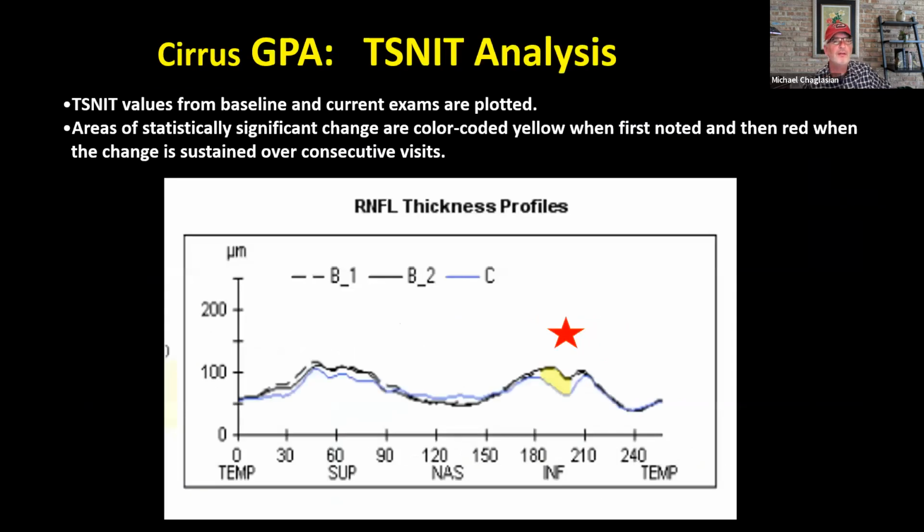And this is what is a trigger for us for identifying someone who has glaucoma and is getting worse, or a normal individual who, as the question was posed to me just earlier, is normal at one point and then progressing and getting worse at some point in the future and truly having disease.